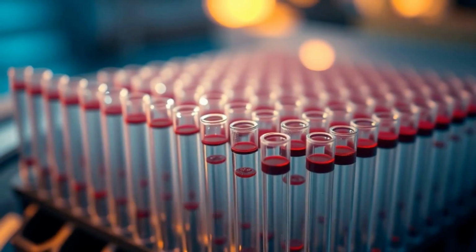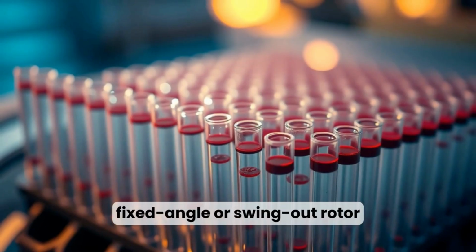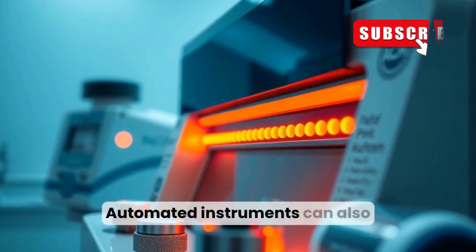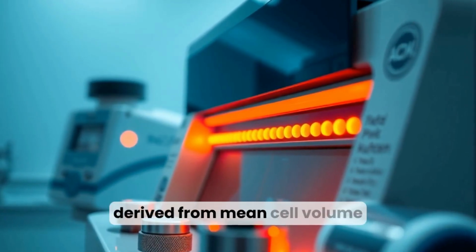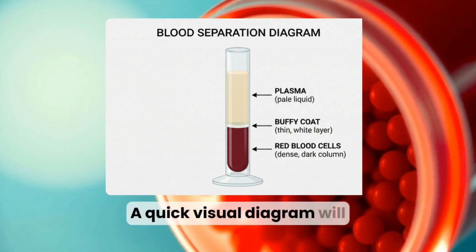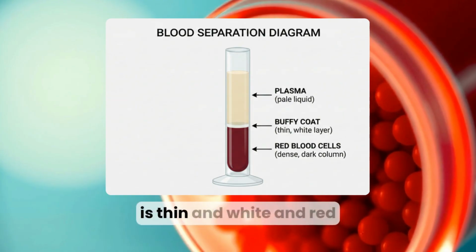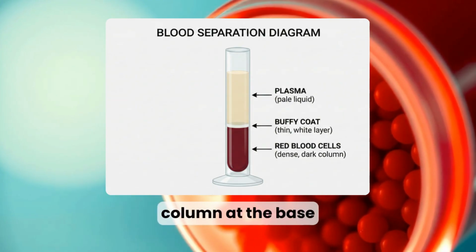Microhematocrit methods use capillary tubes spun in a fixed angle or swing-out rotor and read with a hematocrit reader. Automated instruments can also report hematocrit, sometimes derived from mean cell volume and red cell count. A quick visual diagram will help. Plasma is pale, buffy coat is thin and white, and red cells form the dense dark column at the base.